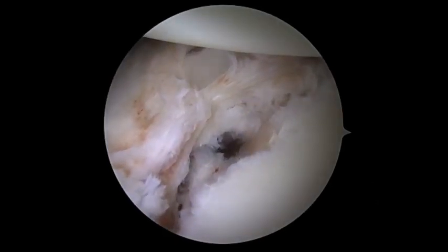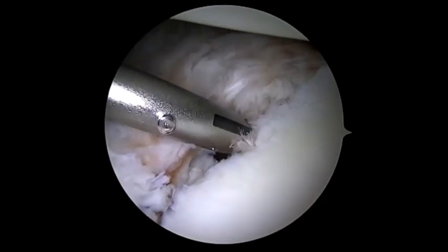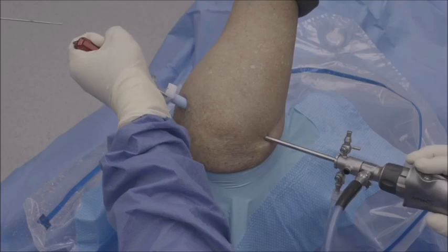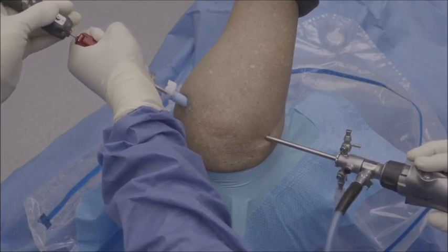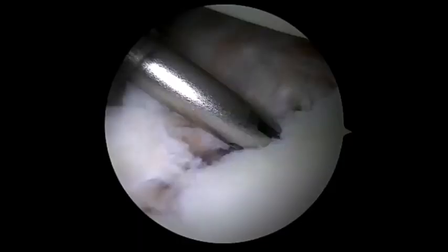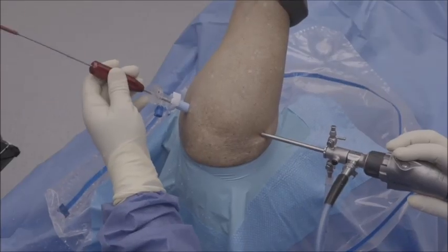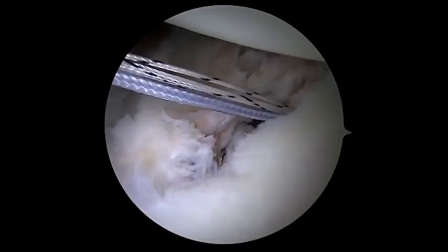Once the pocket is created, an anchor is placed. We use a curved guide in order to place a knotless anchor just below the articular surface. A flexible drill is used through the curved guide, followed by the anchor being tapped in place. Once the anchor has been tapped appropriately in place, the sutures are cycled in order to make sure that the graft will be able to slide easily over the repair stitch once the graft is ready.